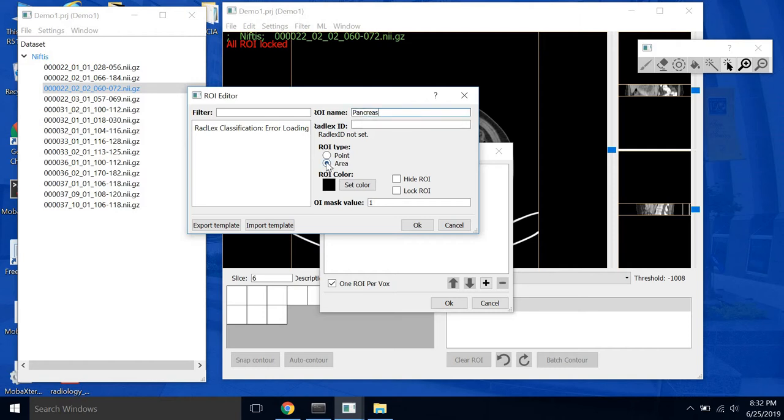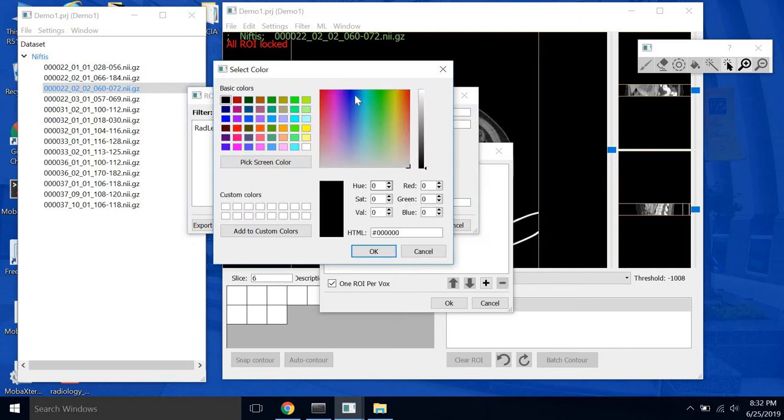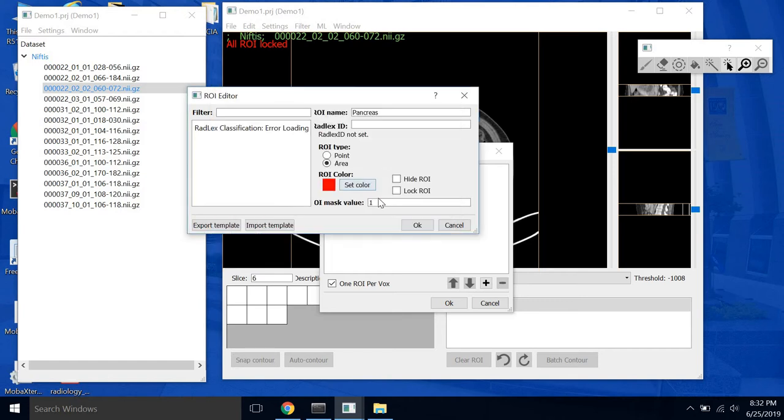Leave this as area. Radlex ID, you have the option to set a Radlex ID which is an identifier to indicate which organ you're segmenting. We'll leave that blank for now. Select the color. We'll go red.